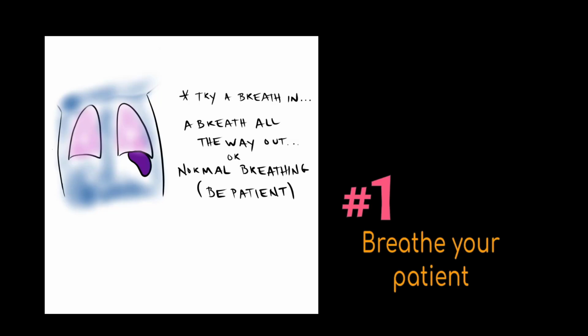Maybe just that tiny little bit of normal breathing in will move the spleen into a good window. Maybe you'll watch as they exhale, and the spleen moves into a good spot then. So you want to watch how their normal breathing affects how you can see the spleen. Definitely try a breath in all the way. And sometimes you can have them take a big breath in and then blow it all out and hold that exhale. That'll keep the lung deflated and hopefully give you a nice window to the spleen as well. So make sure you're trying different breathing techniques.